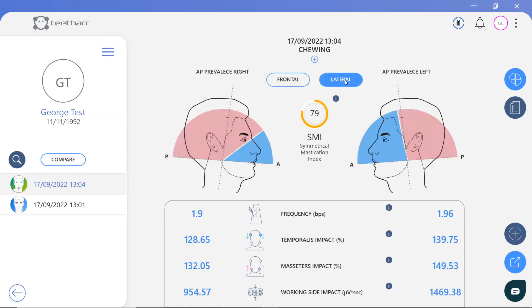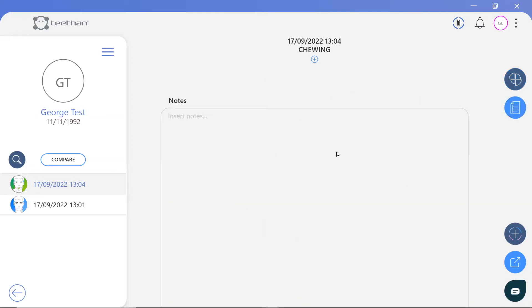You can also view the anterior-posterior prevalence for the left and right side by viewing the lateral plane. In this case, the left chewing is well balanced, but there is a high posterior prevalence when chewing on the right side due to the high masseter activity. Finally, you can make any notes about your patient and propose a treatment pathway in the notes section of the software.